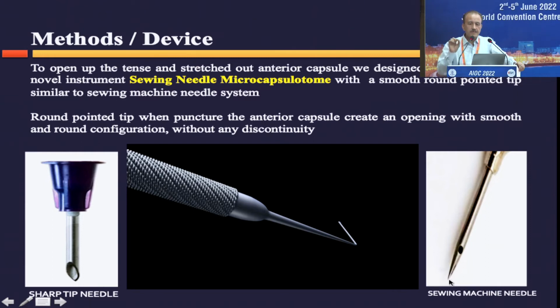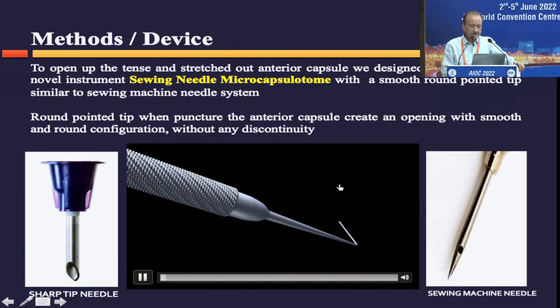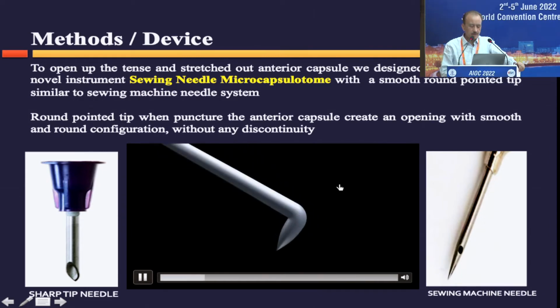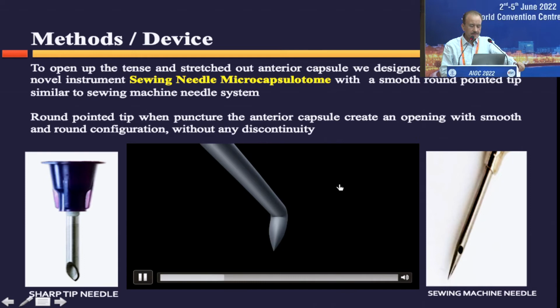It's a round and pointed tip, unlike the sharp and knife-like tip of the hypodermic needle. Now when this device pricks the anterior capsule, it will make a hole on the anterior capsule. Now you can see this device.